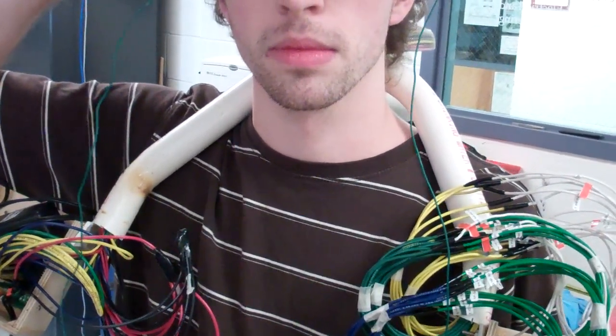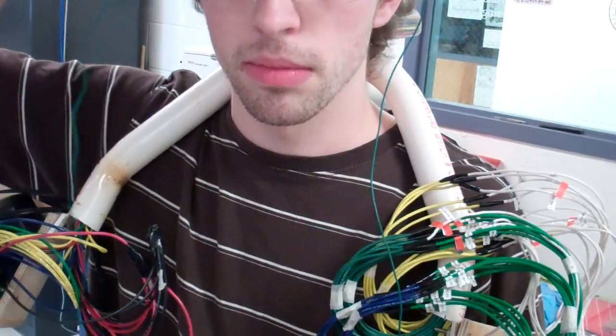So that's where all these wires came in that go to the actual photo transistor channels. And you're going to pull on those two wires to pull it tight against your motor cortex. And then how do you monitor what's going on?